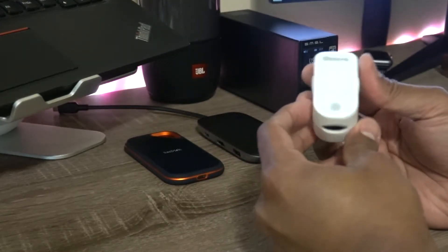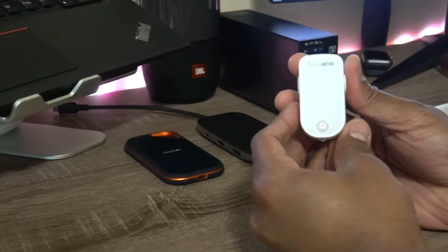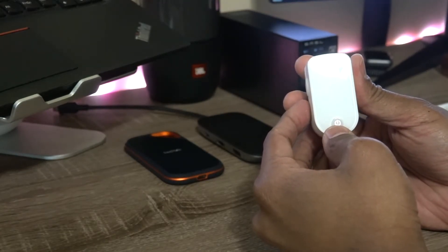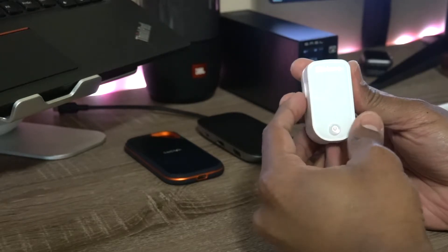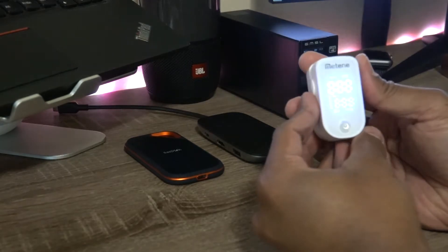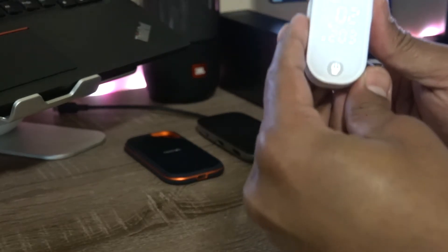It's very lightweight too. It has just got a power button on the front and a display which is not visible — unlike other oximeters available in the market. That's one thing I liked a lot.